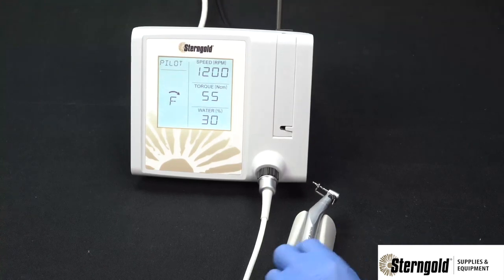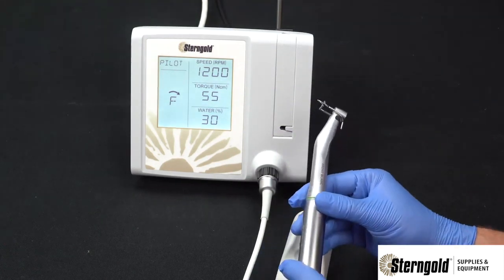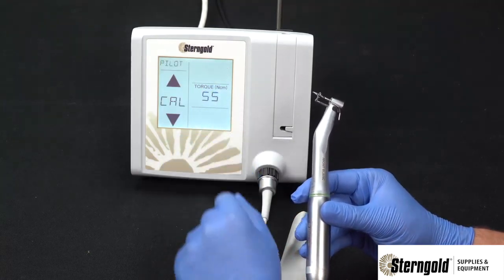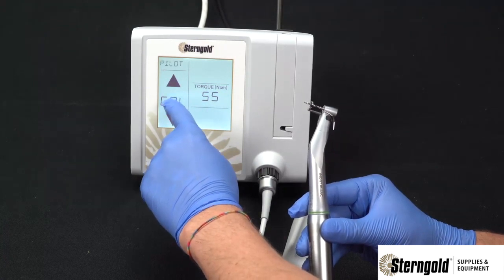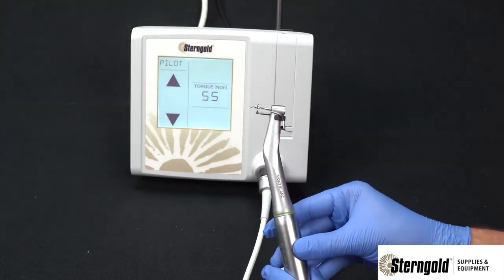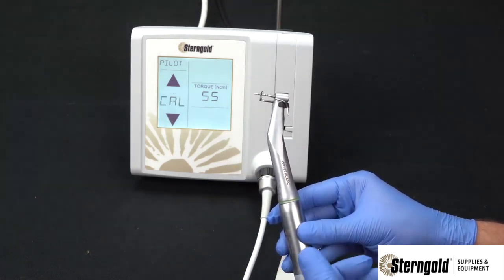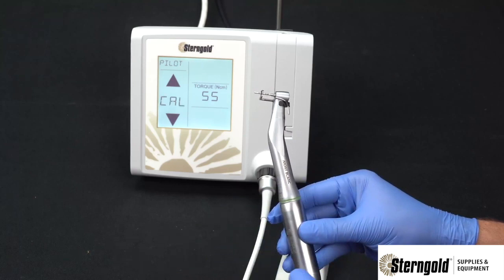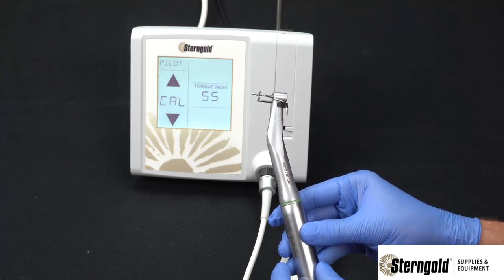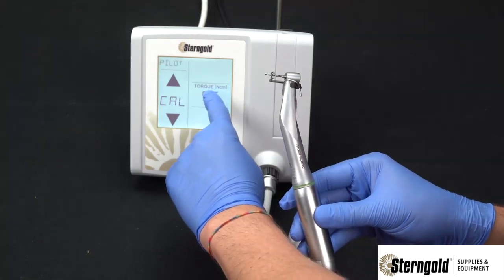To ensure accuracy between the settings on the display and the burr, this unit includes handpiece calibration. To run that test, press the torque section of the operating screen and quickly press the cal button. The handpiece will begin to rotate from low speed to high speed, sending mechanical performance information back to the motor so that it may adjust itself, ensuring that the speed and torque shown on the screen will be accurate at the burr. Once the cal stops flashing, testing is complete. Return to the operating screen by pressing the torque section of the display.